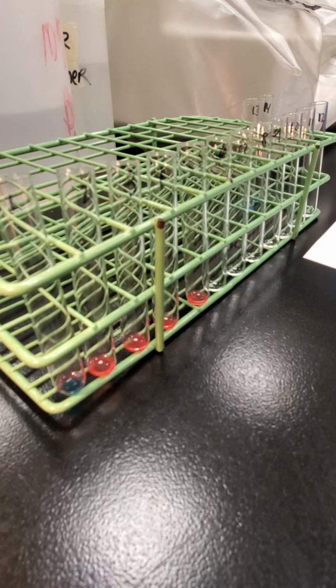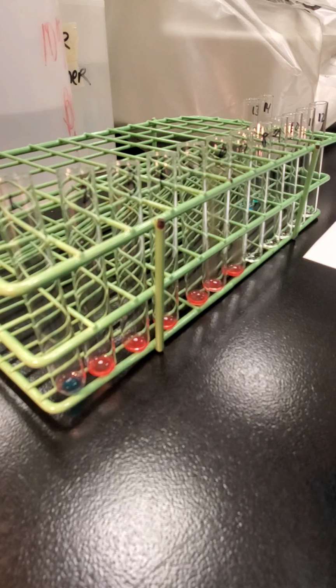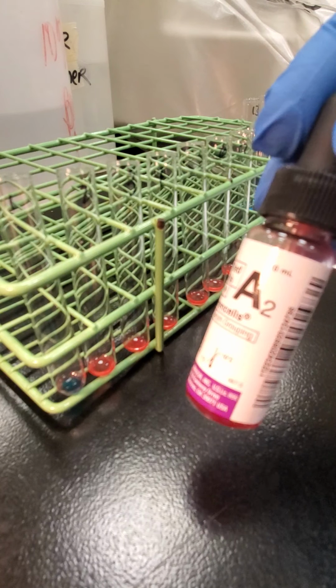Okay, and then 6 and 7, I'm going to add our A1 cells. Okay, and then 8, I'm going to add our A2 cells.